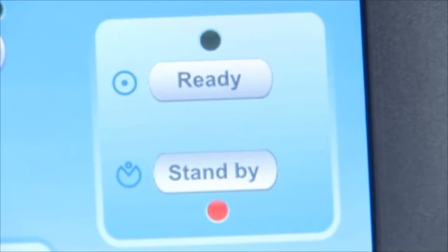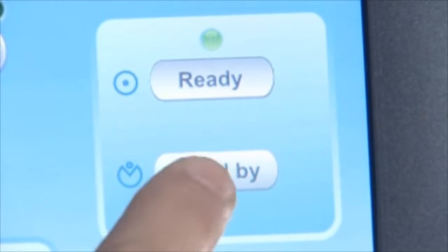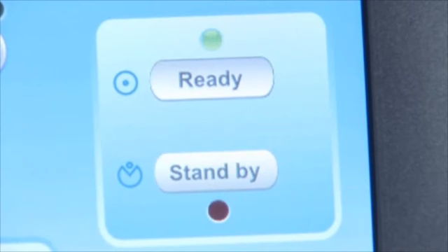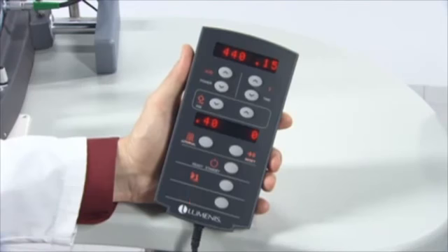To select the laser mode from the control screen, press the Show button Ready for Ready mode, or press the Show button Standby for Standby mode. The laser automatically switches from the Ready mode to Standby mode if it remains idle for more than 5 minutes. To select the laser mode from the remote control, press the Ready/Standby selector to toggle between Ready and Standby modes. The icon for the selected laser mode illuminates.